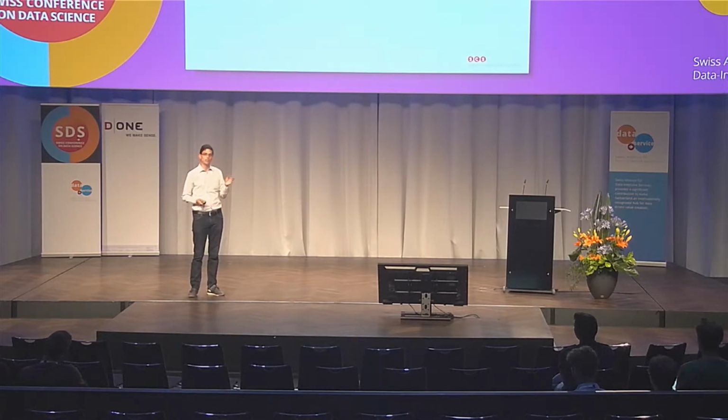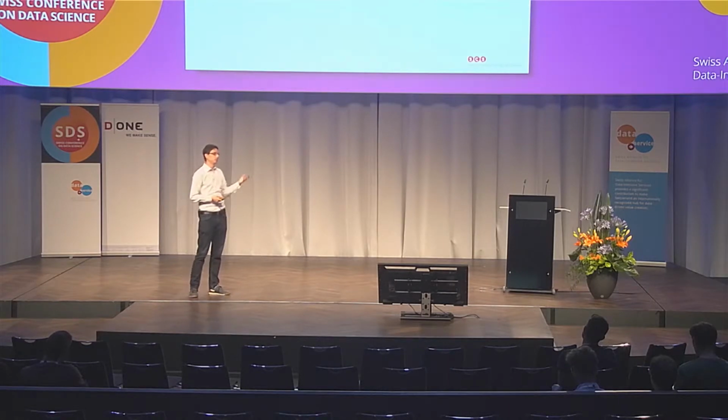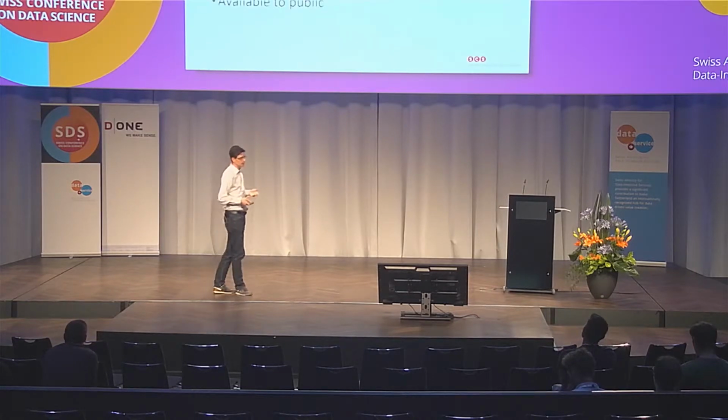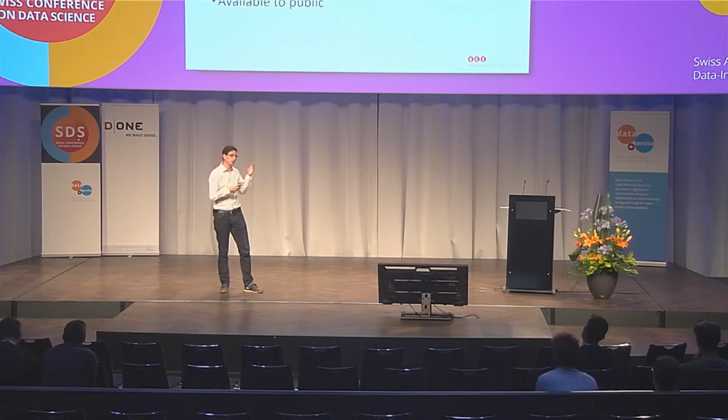Now, ophthalmologists are eye doctors, and we want to provide those ophthalmologists with an AI-based system so that they can do automated retina segmentation of retina images. By this data, we want then to detect irregularities in eyes, and we want to do volumetric analysis. And basically, we want to make that system available to the public, so that it can not only be used by one doctor, but by doctors around the world. These are our goals.